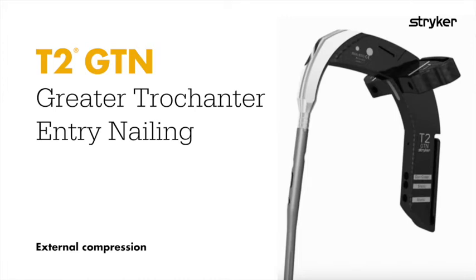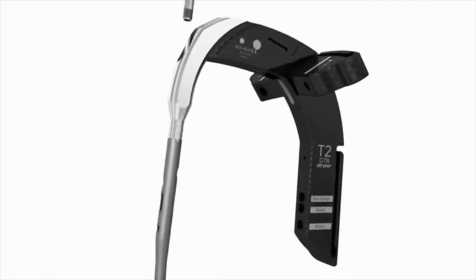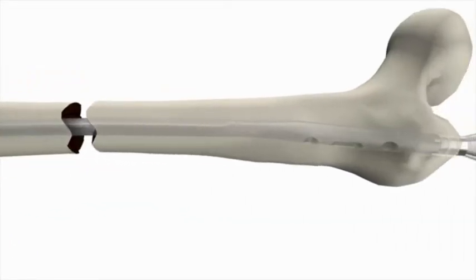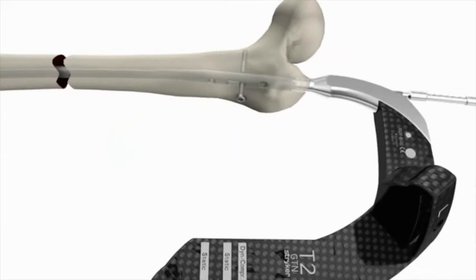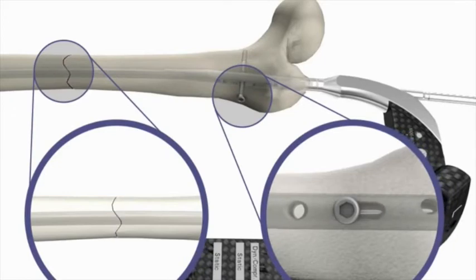The T2GTN system allows for up to 10 mm of active mechanical compression. After nail insertion and distal locking, place a partially threaded locking screw in the targeted dynamic compression hole. Thread the external compression device into the nail holding screw and compress the nail with clockwise revolutions.